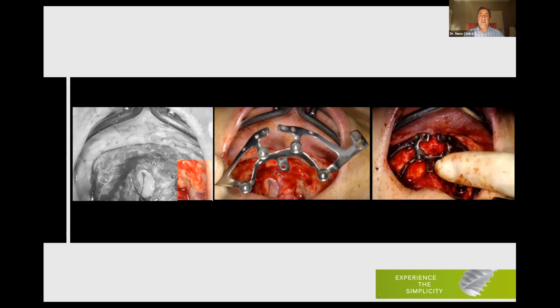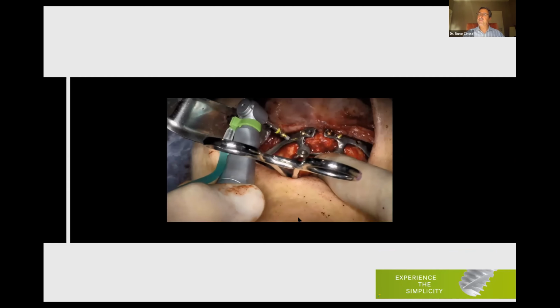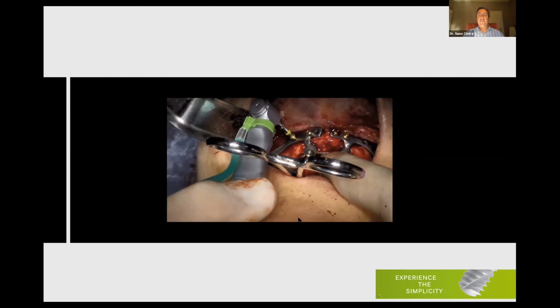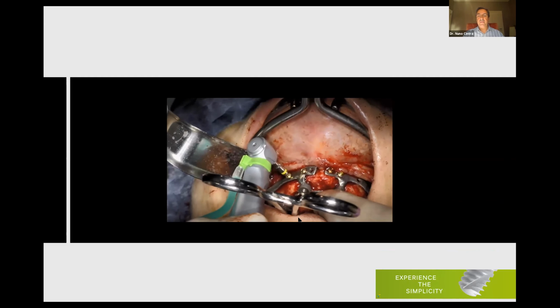So this is the implant. This is the 1-piece implant. As I said, you can choose a 1-piece or 2-piece implant. And now let me show you, although this is a titanium implant, which is hard, of course, it allows for some flexibility. As you can see, the implant has to be passive.